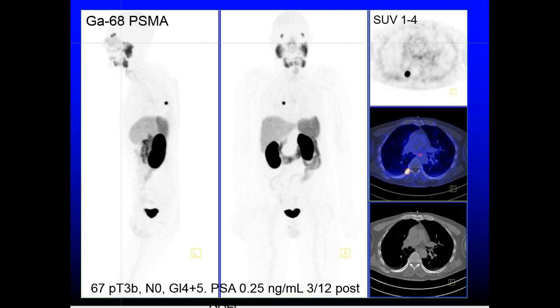Lastly, some of you will be aware of this, that gallium PSMA is the new kid on the block and can be very successful at detecting the presence of metastases. And you can see this patient's PSA is only 0.25, 3 months after surgery, and he has a lesion in the rib which is not detectable by any other means.